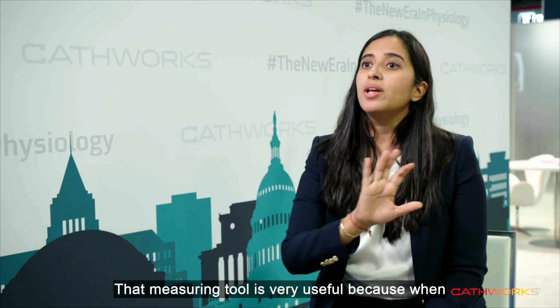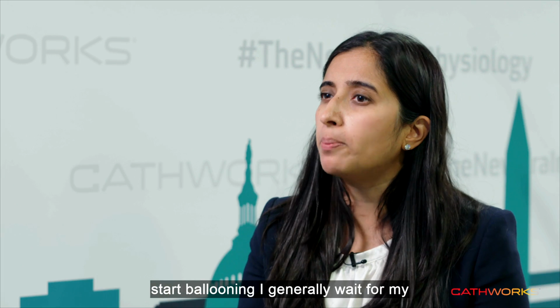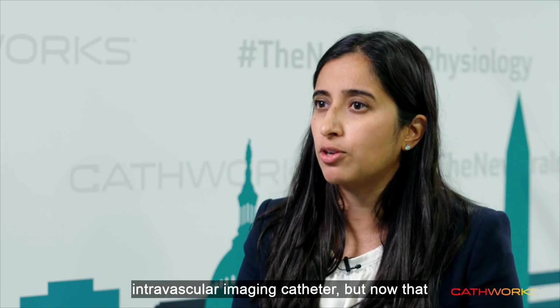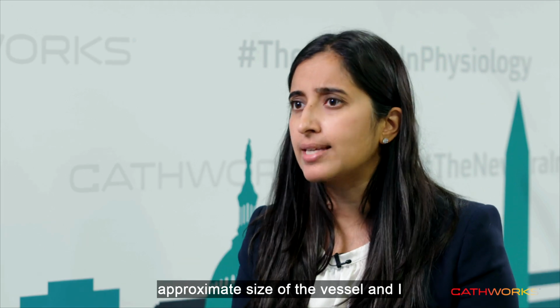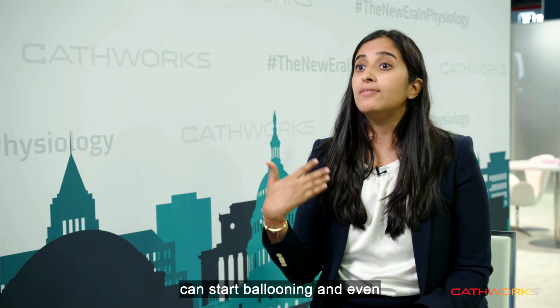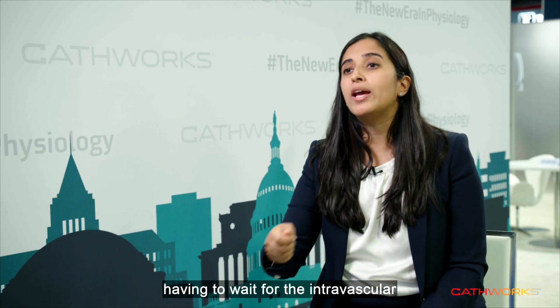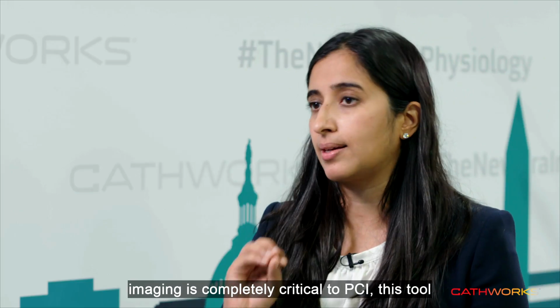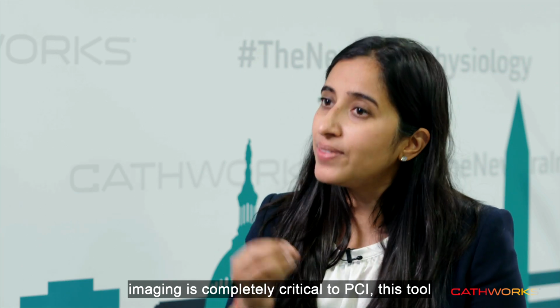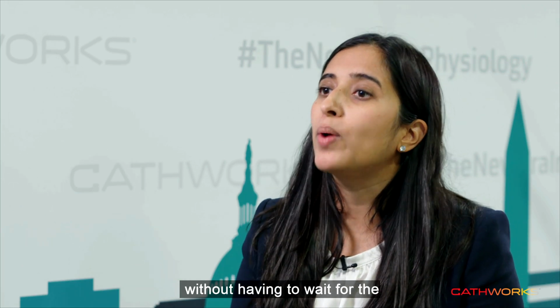That measuring tool is very useful because when I do a physiologic assessment, generally to start ballooning, I generally wait for my intravascular imaging catheter. But now that CathWorks has the measuring tool, I know the approximate size of the vessel, then I can start ballooning and even planning my stent if the plaque morphology seems reasonable without having to wait for the intravascular imaging catheter to get set up. So while I still think intravascular imaging is completely critical to PCI, this tool allows me to get started on the ballooning at least without having to wait for the intravascular imaging information.